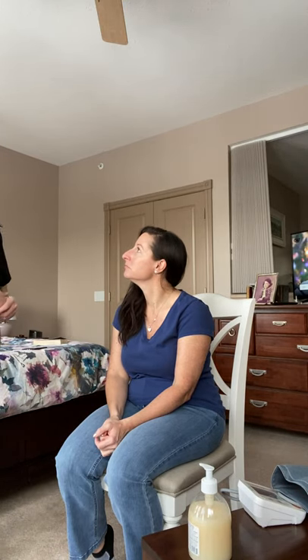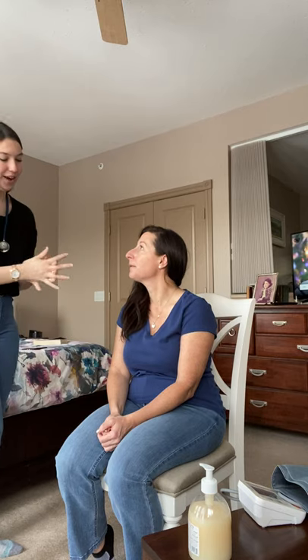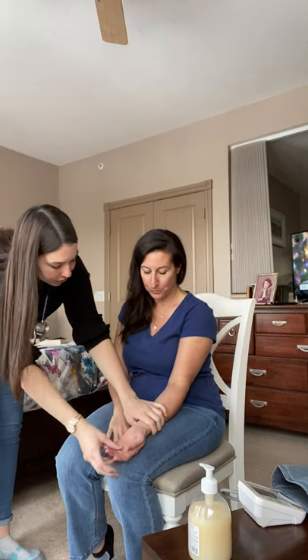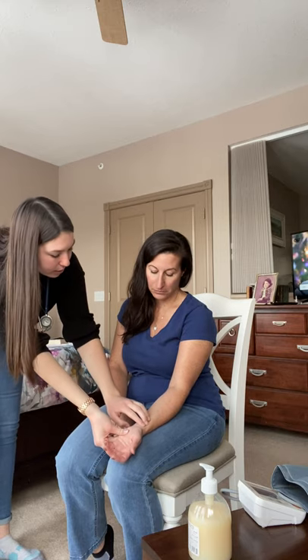Hi, my name is Morgan. I'm a student practical nurse here. Is it alright if I check your vital signs? I'm going to start with your pulse first. Is it alright if I touch you? We'll place your arm right here, just relaxed, and I'm just going to check for your pulse. Make sure everything's okay with the rate, the rhythm, and the volume.